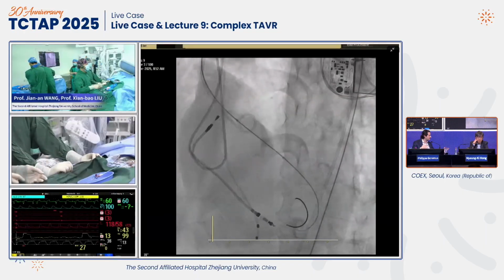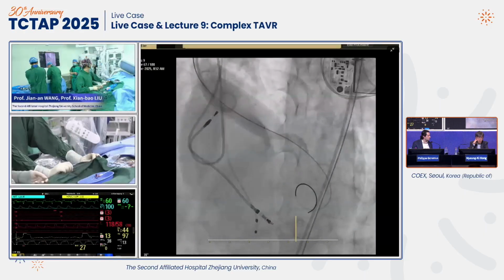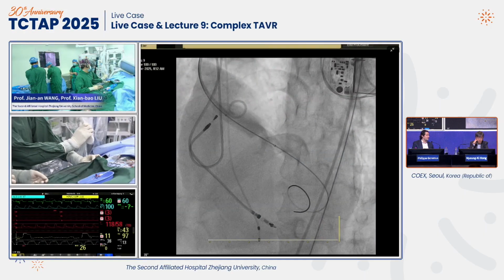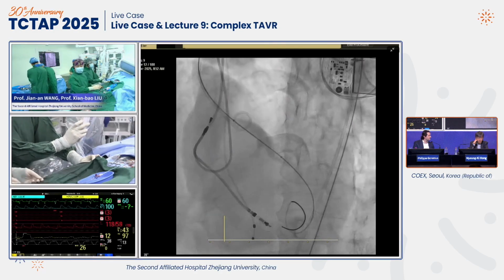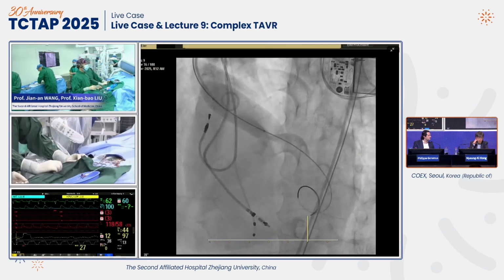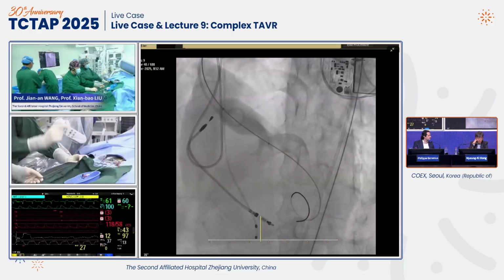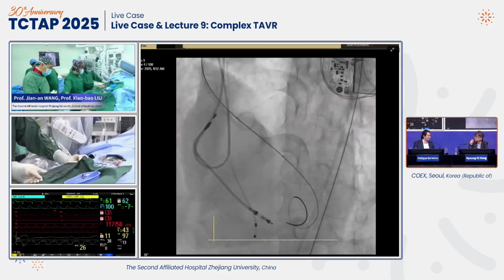Okay, it's 446, 450, because to your point, the calcium didn't move. It's 141 with a 23. I think the 26 might have been okay as well, because you're right, the calcium didn't move at all. If you use a self-expanding valve, I think the risk of the valve under-expanding is high. If you use a balloon-expandable valve like a Sapien, the rupture risk is high, I think.